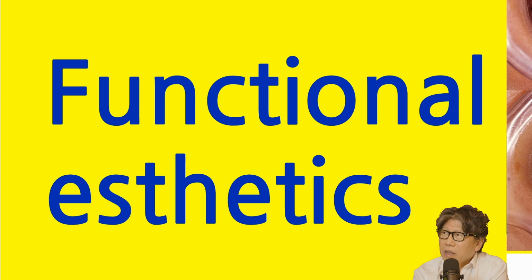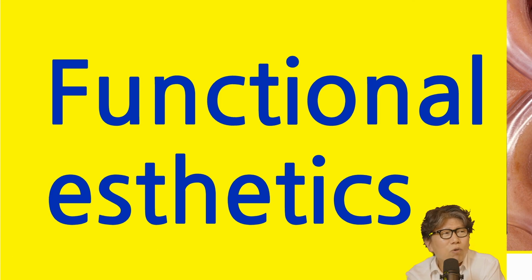So, actually, I was in China recently, and what the Chinese dentists were telling me is that implants don't last very long. I guess China is going crazy right now. Well, actually, the Astra connection, for example, old abutment connection, it's pretty much adopted by our domestic implant companies now. It starts to loosen after about 5 years. I think it's my understanding that after 10 years, 10% of them come loose or break. I think that's something that most of us agree on.